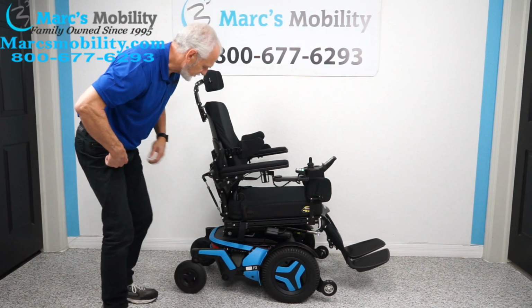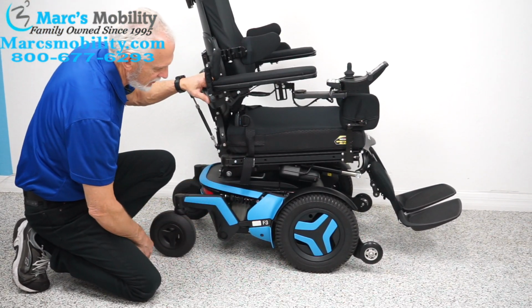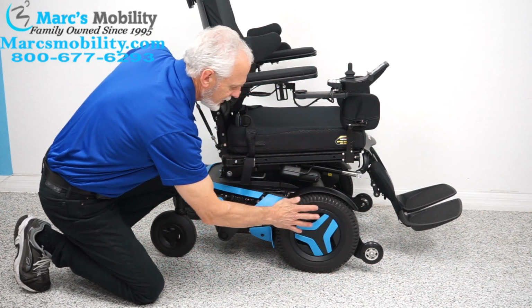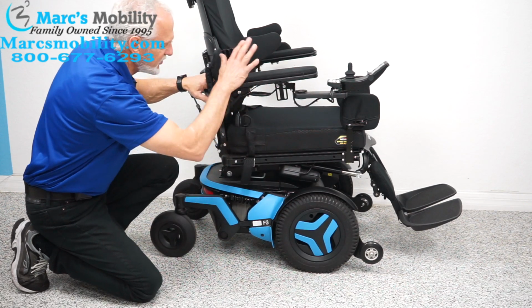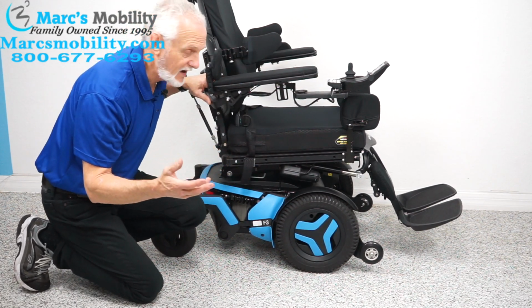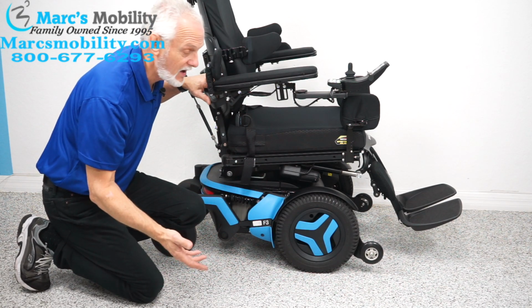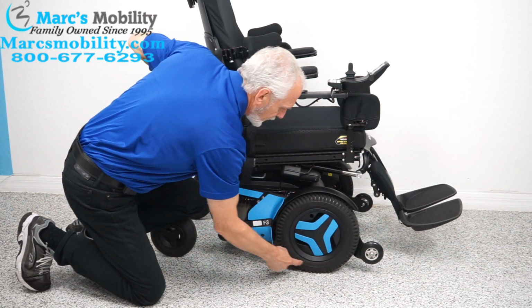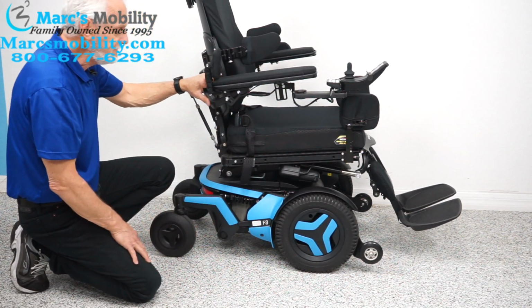Let's look at the base on this chair. This is one of my favorite colors. This is a nice blue color. This is a front wheel drive. That means there's nothing on the ground in front of this wheel right here, okay? So the chair weighs about 375 pounds. So if you have a 200-pound user and 375, that's 575. All that weight is going to be carried right here, okay? So it'll give you good traction if you're in the grass, okay?